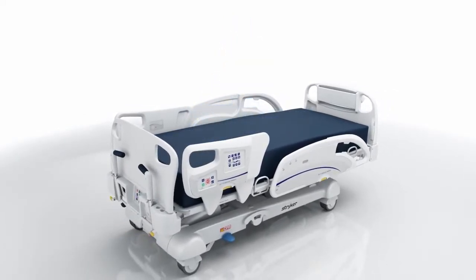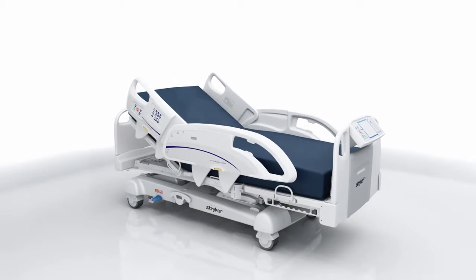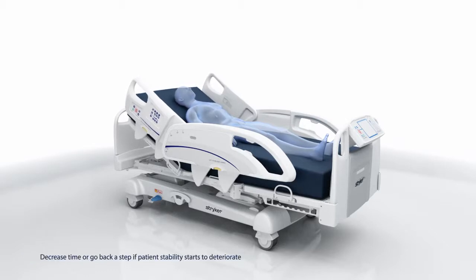To initiate early mobility when your patient shows signs of readiness, start each step with brief time intervals of 15 minutes and increase to 30 to 60 minutes each as patient tolerates. Progress to the next step when the patient demonstrates general criteria for advancement to the next step. Decrease time or go back a step if patient stability starts to deteriorate.